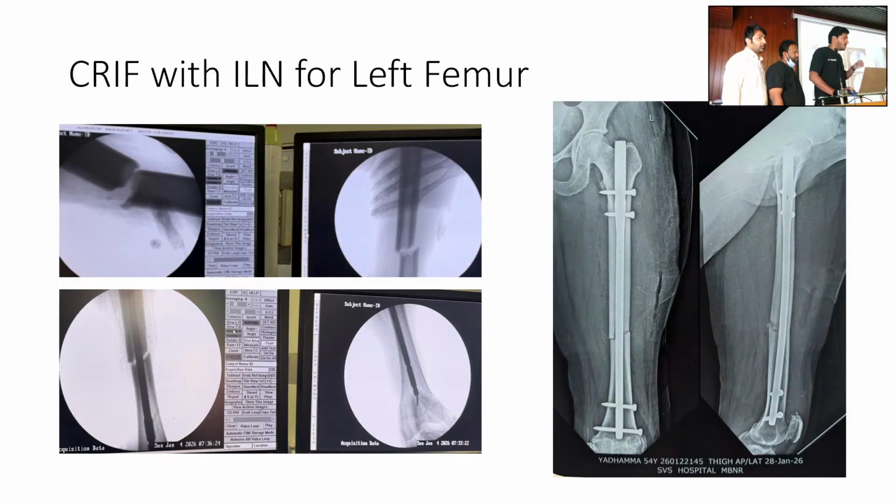What is the best way? This point has already been discussed several times. Do the distal locking, don't lock the proximal one. And then take a ramrod. What is that?